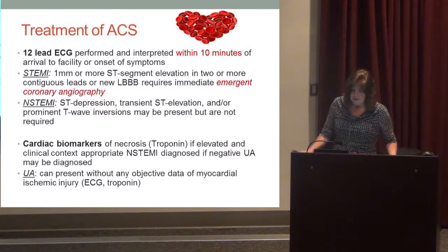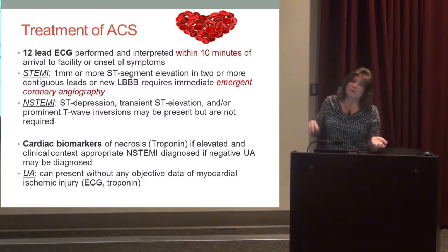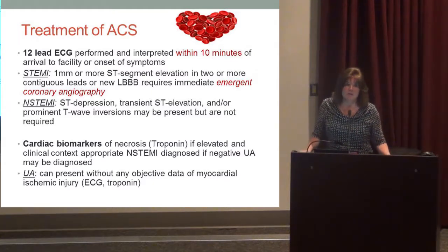Okay? All right, treatment. We all know we need to get that 12-lead EKG within 10 minutes of arrival. ER is really great with this. They have a very good system. Yes, they're doing EKGs. On the floors, not so well, right? Patient has chest pain, they've got to call the resident, they may have to call the fellow, they're not sure which resident is taking care of the patient. Just get that EKG within 10 minutes. It's our guidelines. It's for chest pain accreditation, that we do have this system in place.